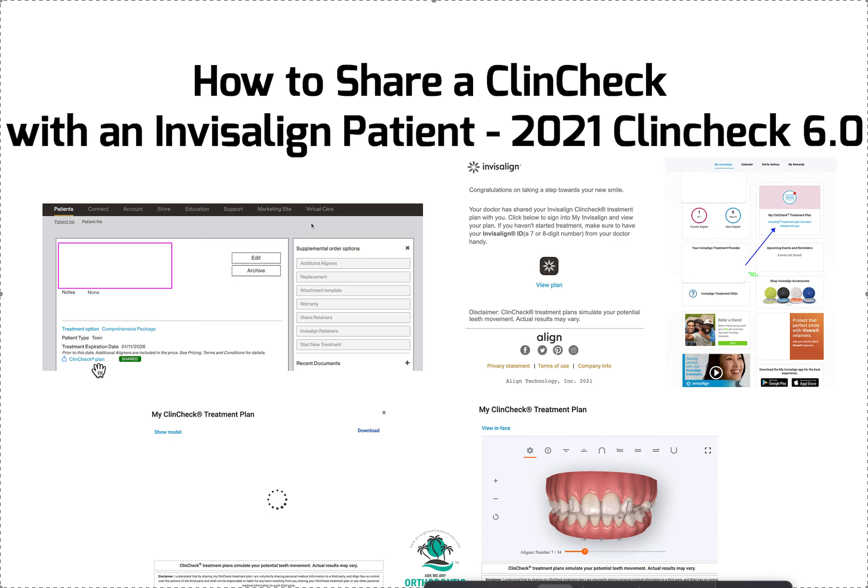Once you click that button — and this is why when you submit the patient you have to submit the patient's information so they can contact them — their email, their phone number, all that kind of stuff. So if you don't populate your patients in ClinCheck appropriately, a lot of people skip sections, then you're not going to be able to do this. That's the main thing.